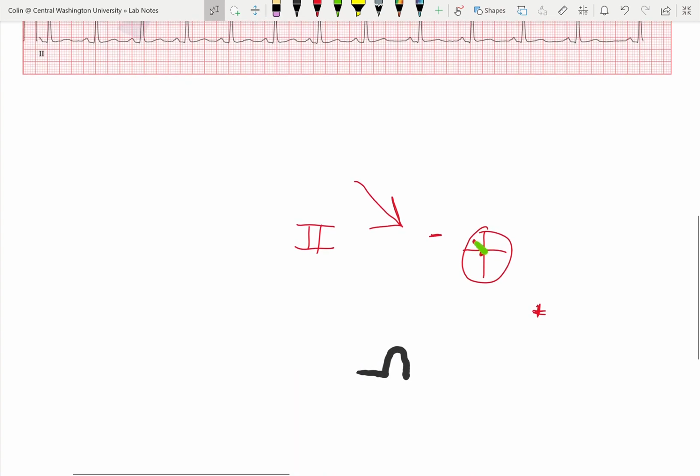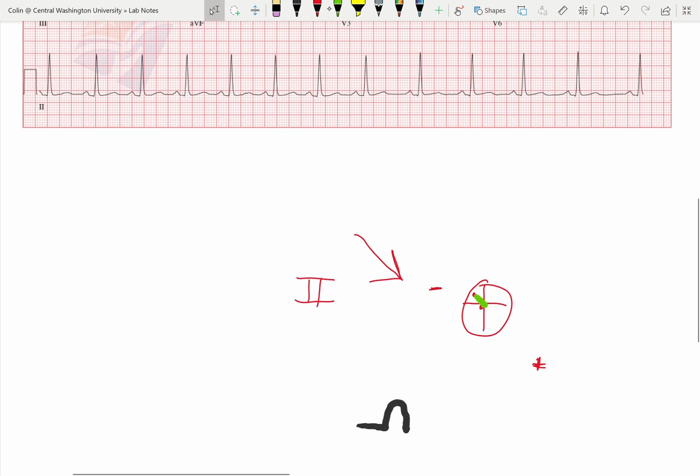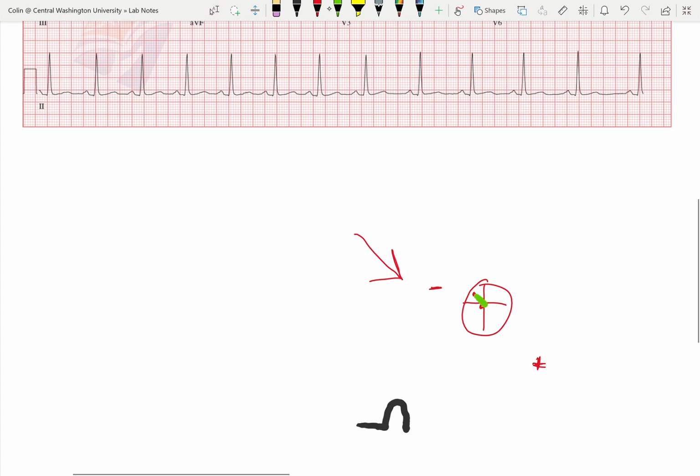It's not the easiest concept to get, but if you want to get really basic, then let's just say we want pretty much everything other than AVR to be positive. And if it's not positive, then there's a problem with the electrical system. The electricity is not following the path that we've been talking about this whole time. It's not going SA, AV down the ventricular electrical pathway. And when we get to talking about heart blocks, and bundle branch blocks, and kind of the more obscure stuff, you're going to notice that the P waves all of a sudden start becoming negative. They start becoming upside down, or the QRSs will get really, really wide and sometimes negative. So again, down the road we'll talk about it, but that's kind of camera angle 101, right?